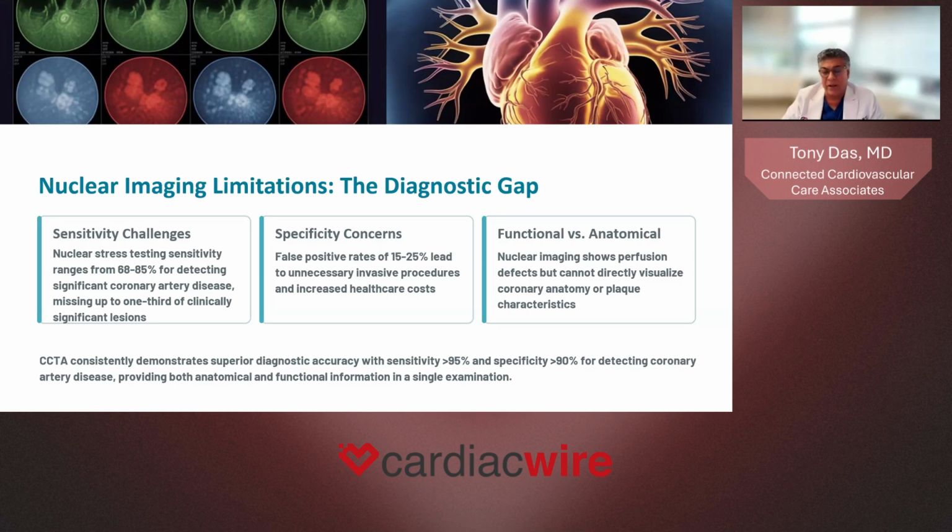I'm an interventional cardiologist, so one of the things that I do is put catheters in patients to identify the gold standard of whether they have coronary disease or not. And the more I'm working with my colleagues here in our practice that are expert imagers like Dr. McPherson and Dr. Rahman, what we realize is that, hey, they pick up coronary disease way better than we do in the cardiac cath lab.